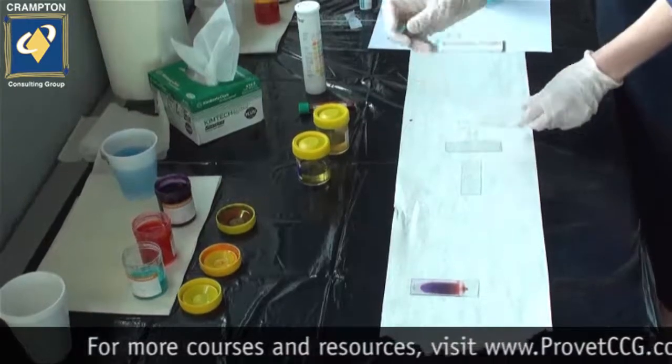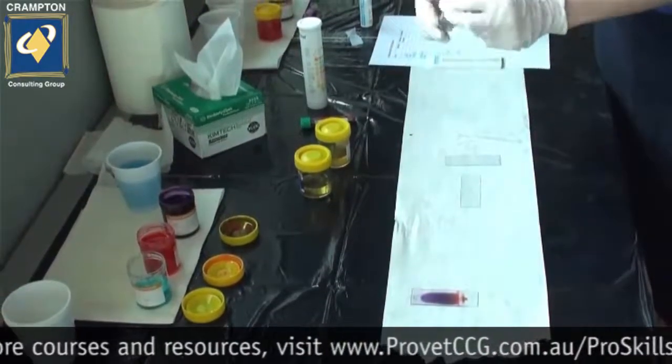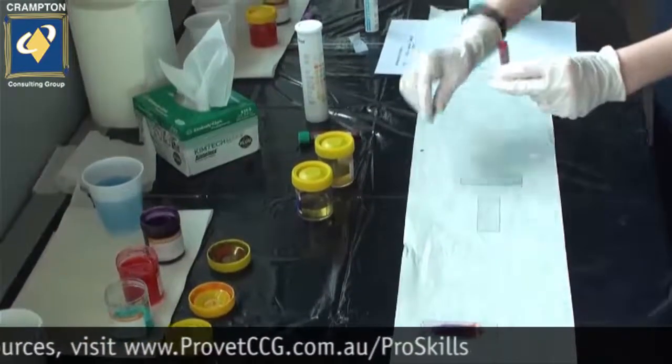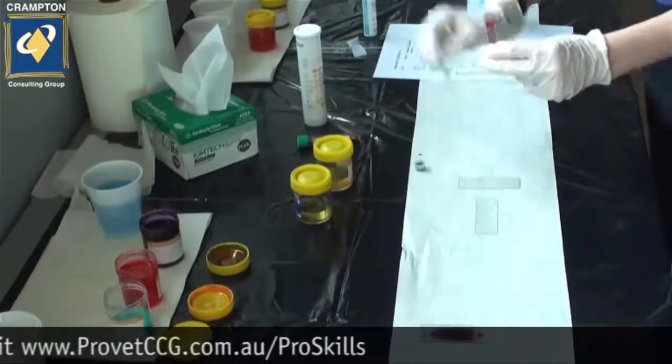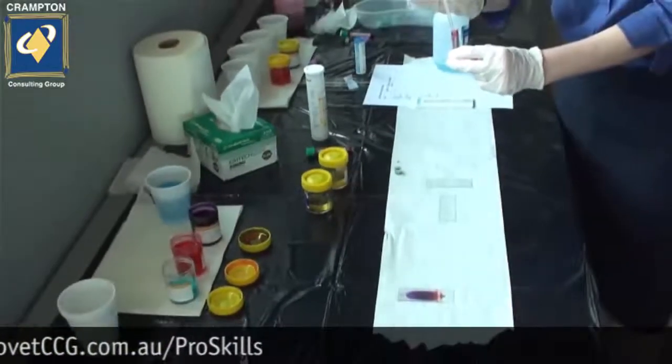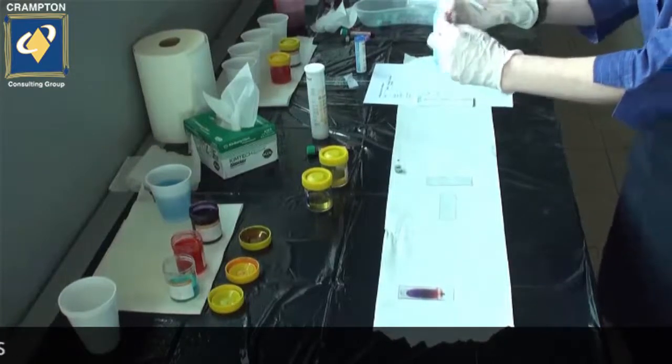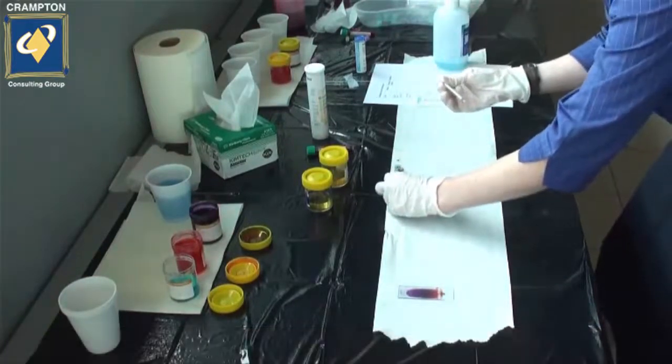Gently agitate your blood sample to adequately mix the red blood cells and serum together. Then remove a very small sample using the pipette and apply a small drop of blood to the end of your slide.